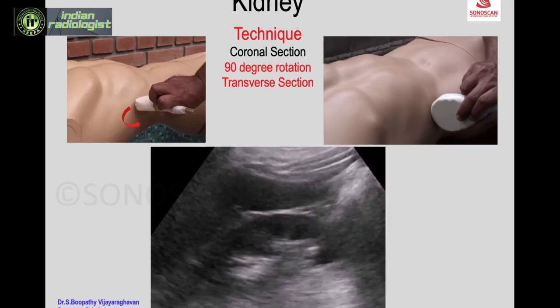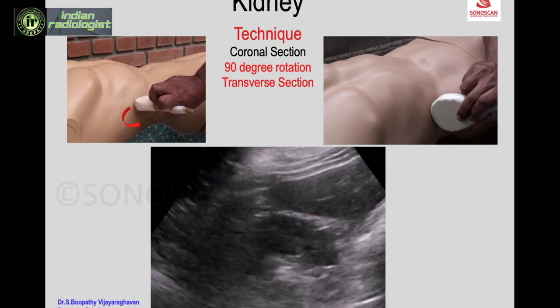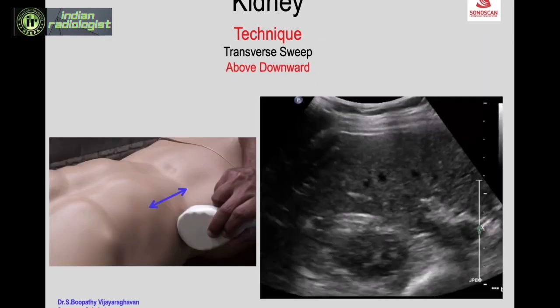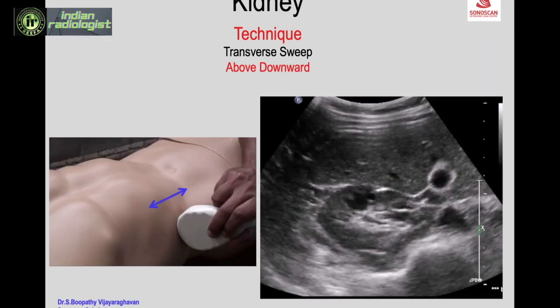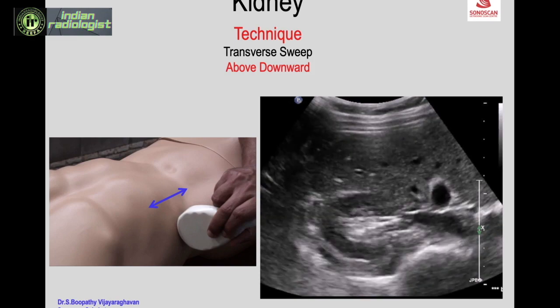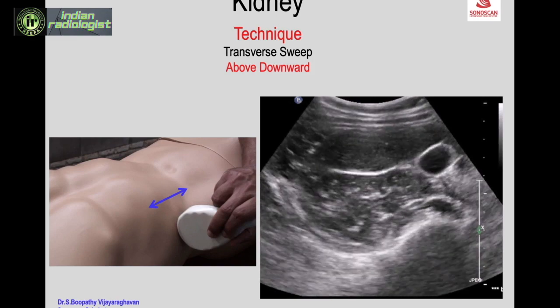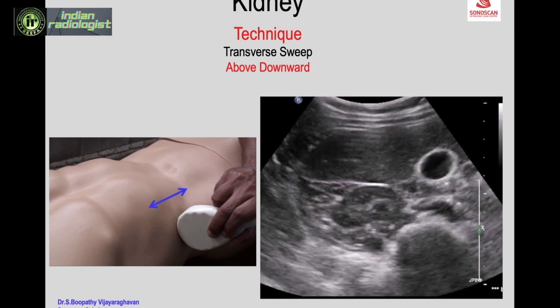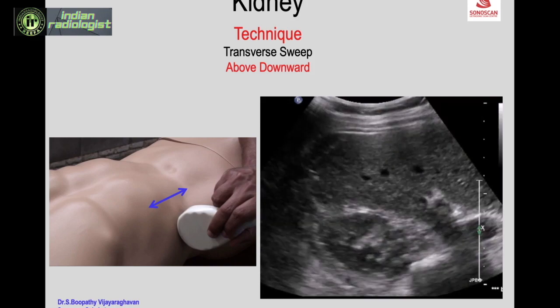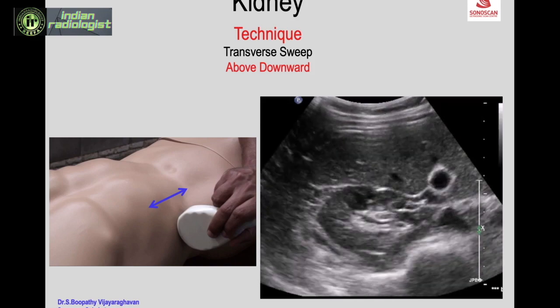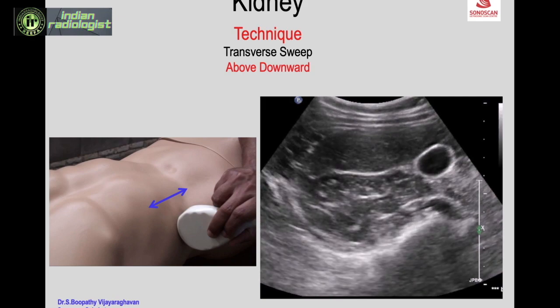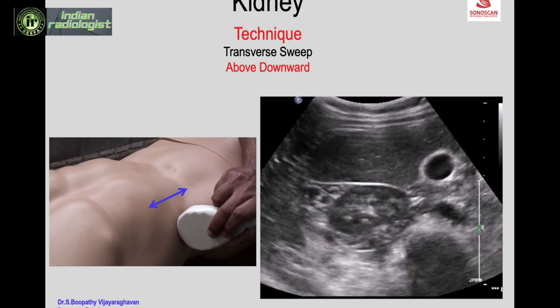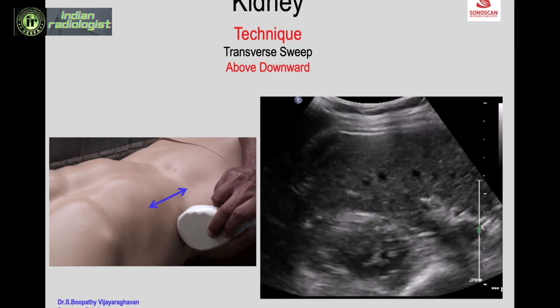Then rotate the probe 90 degrees to get the short axis or transverse axis of the kidney. Once you get the transverse axis — here on the mannequin it is shown from the flank but the video image is from the anterior aspect — go above and downwards in the transverse axis to scan the entire volume. The entire volume of the kidney should be scanned in two planes: either coronal or sagittal, and transverse.